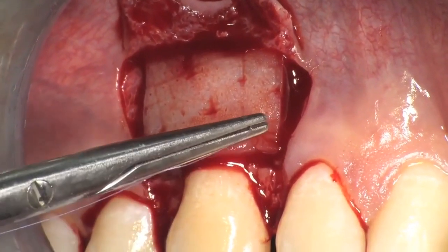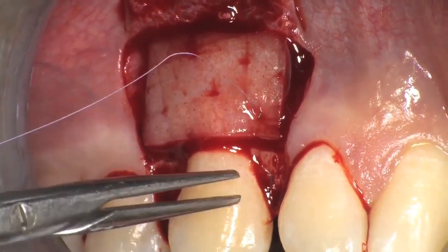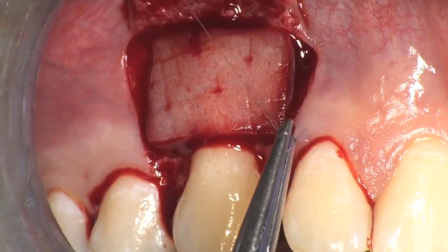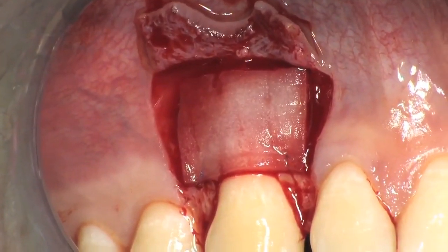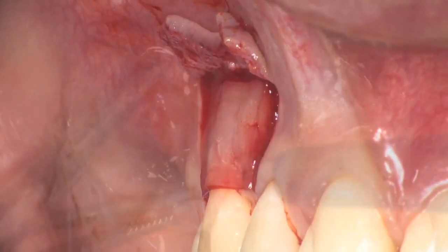The mucoderm is placed in situ. It must be positioned 1 mm coronal to the cemento-enamel junction and extend 2 mm apically with respect to the buccal bone crest. 7-0 PGA sutures are used to fix the mucoderm with interrupted sutures at the base of the anatomic papillae.